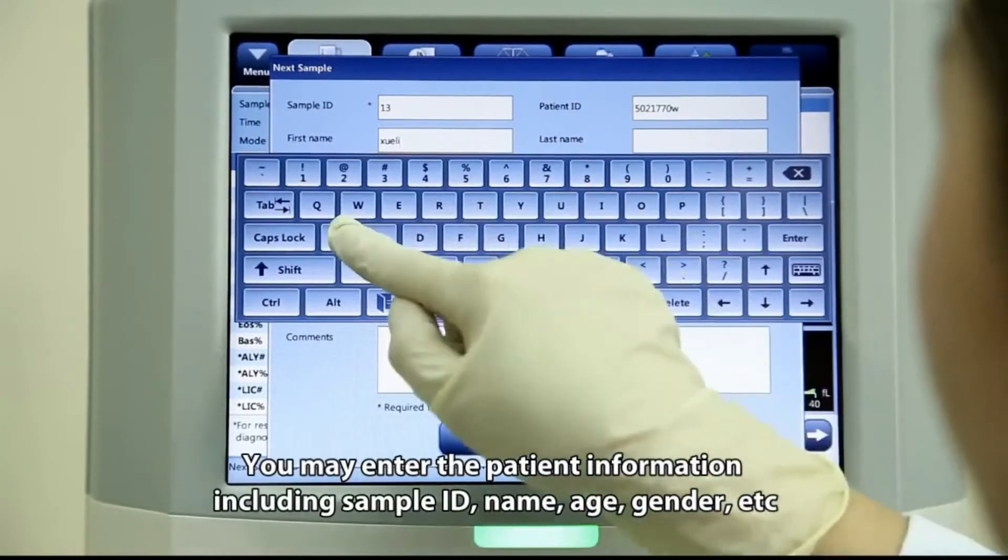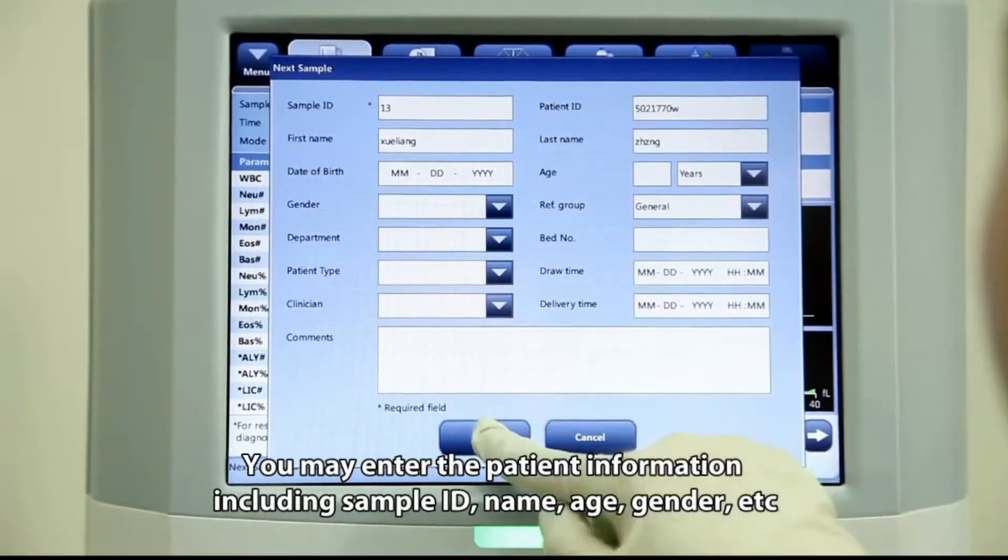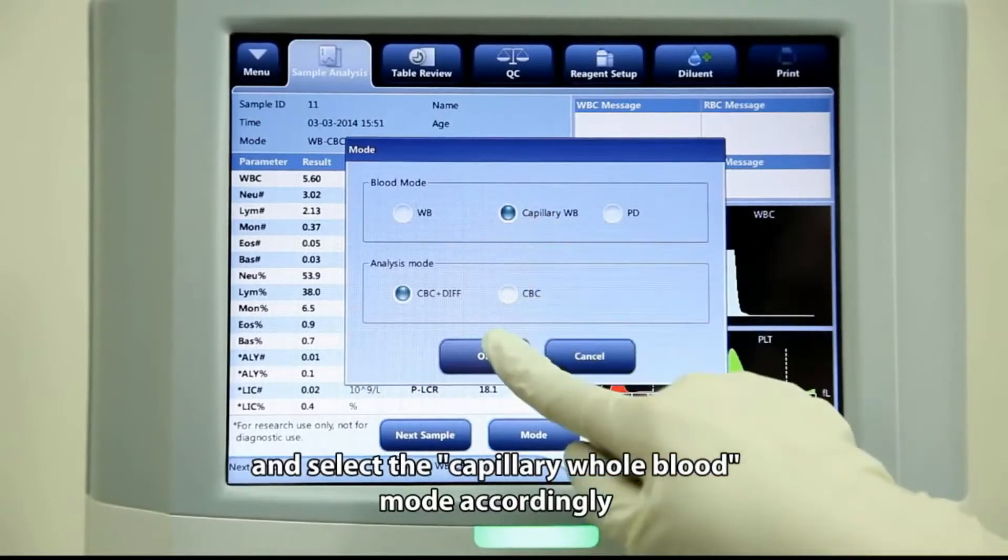You may enter the patient information including sample ID, name, age, gender, etc., and select the capillary whole blood mode accordingly.